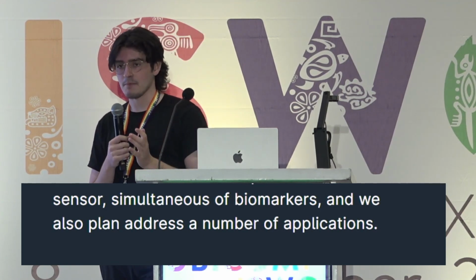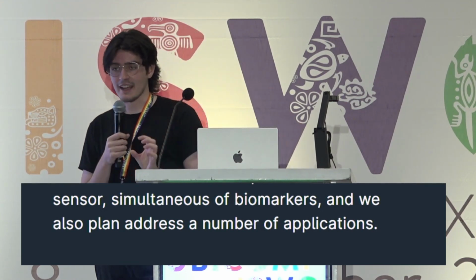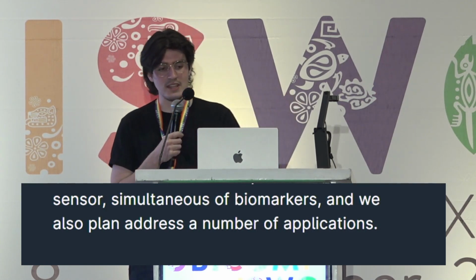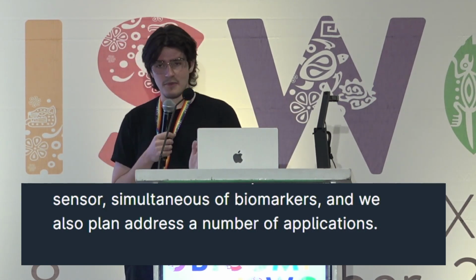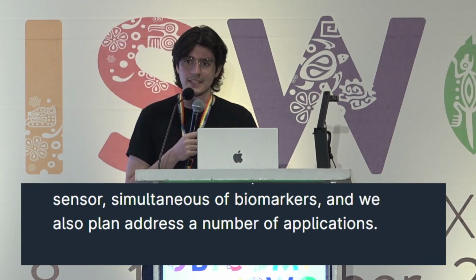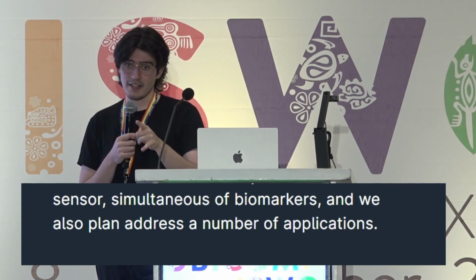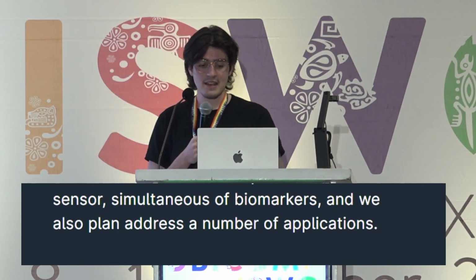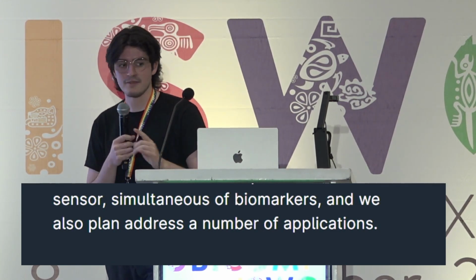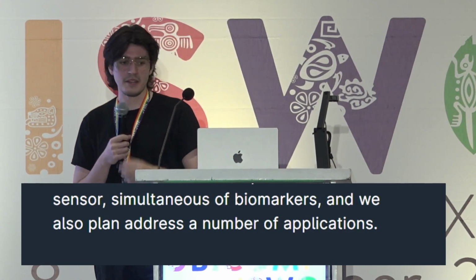But we don't want to wait 8 minutes to get a measurement. And so we actually just looked at the first 90 seconds of contact. So the user brings the phone in contact with their forehead. And you see that over this 90 seconds, the rate of transfer from the user's forehead to the phone is actually roughly linear. And so you can just fit a linear curve to this first 90 seconds and map features describing this line of best fit to the temperature that it would converge to given the full 8 minutes of data collection.